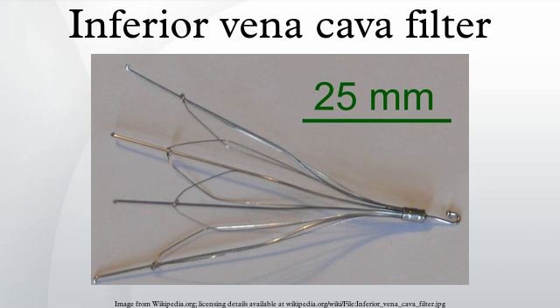Indication categories: while many studies have been done on the efficacy of vena cava filters, there still have not been any major studies done on the actual placement and removal of the filters regarding standard guidelines. Which is why the Society of Interventional Radiology created a multidisciplinary panel that developed the following guidelines to see if someone qualifies for implantation. Absolute indications: these are patients that should strongly consider having IVC filter placement, as they are at greatest risk of pulmonary embolus.